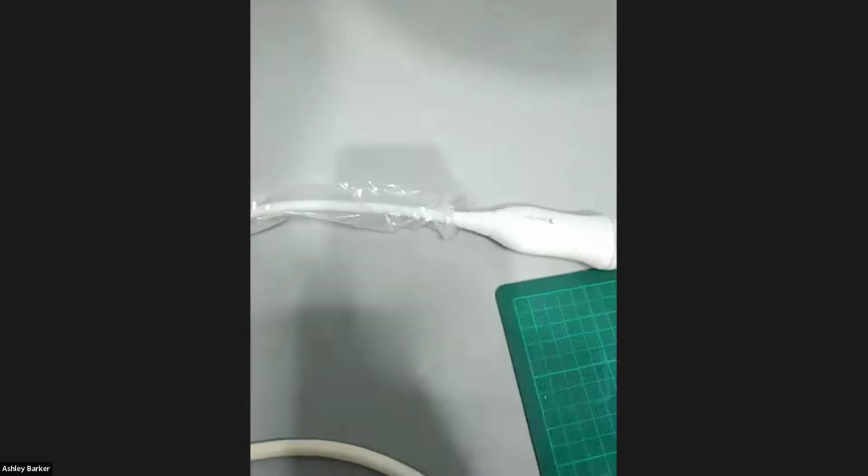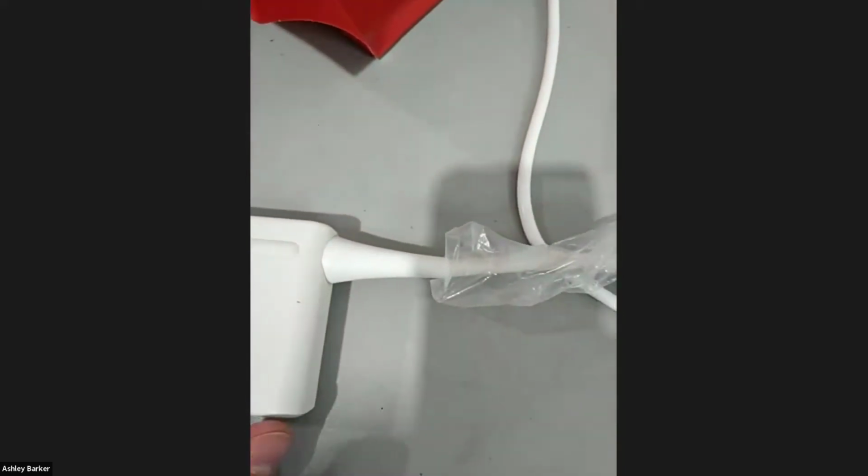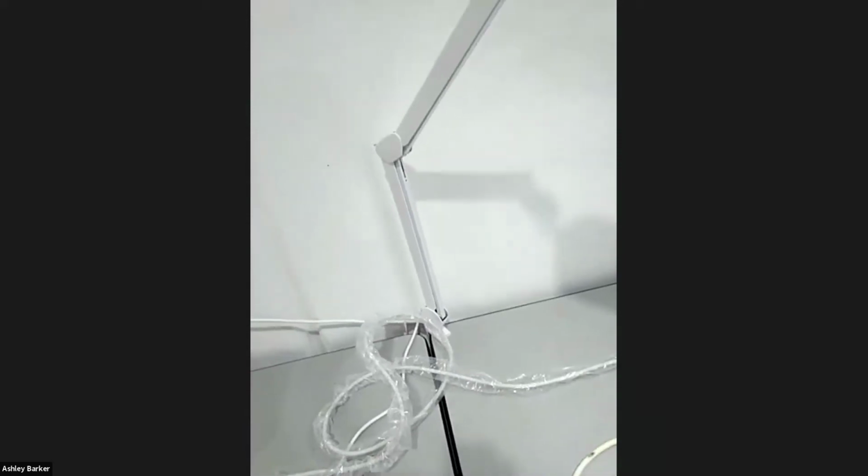On a lighter note, is any of it gold? So if it's broken, can you just melt it down and get rich? Because isn't gold one of the best conductors? Yeah. So this probe has had its cable replaced. We've just finished that job. It's for a customer. And yeah, each end needs soldering. Wow. So yeah, it's a big job.